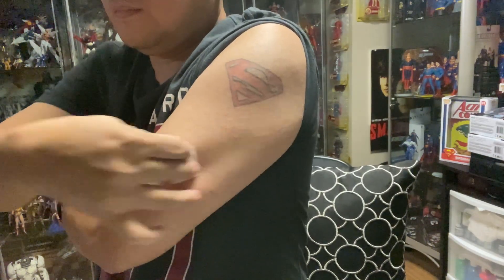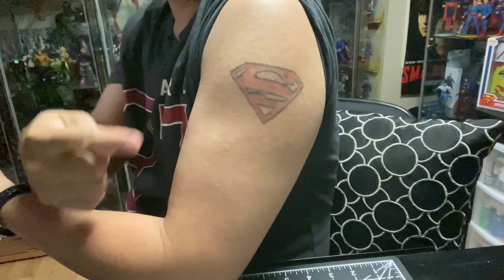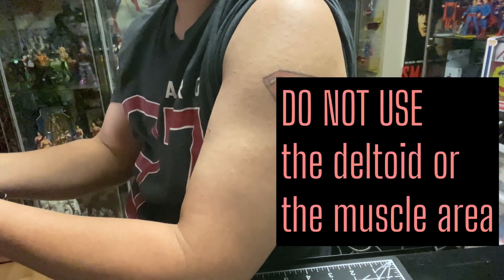Cleanse the site. Use the underside of the upper arm.